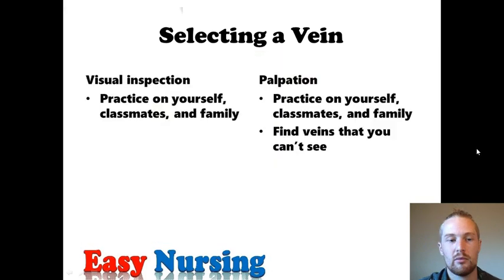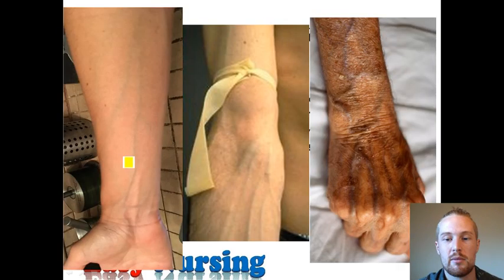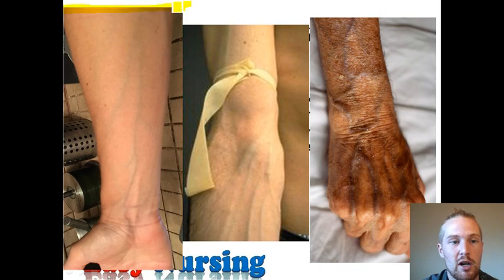So now let's look at 3 different arms I picked here, and where I would choose to start an IV. So this vein here, I'll be going just off a look. Even though you see it coming up a little bit, you probably can't palpate these very well, at least not as well as this. So what I would do is, this really would depend on visualizing the vein. So probably would have my tourniquet up here by the AC or just above.